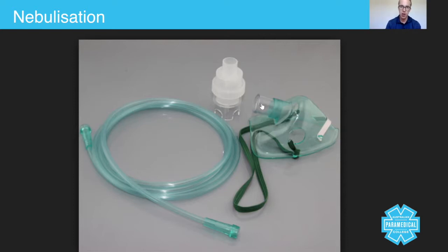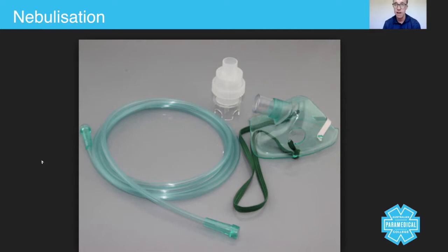You place the top end into the top part of the mask, then you connect one part of the oxygen tubing under here and the other part of the oxygen tubing plugs directly into the oxygen therapy.